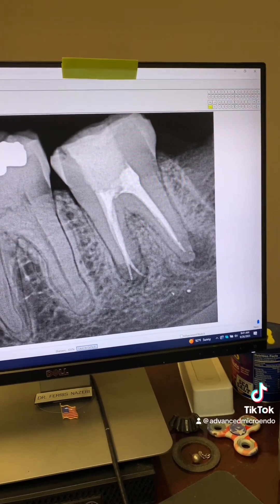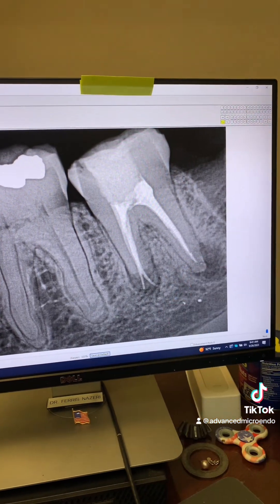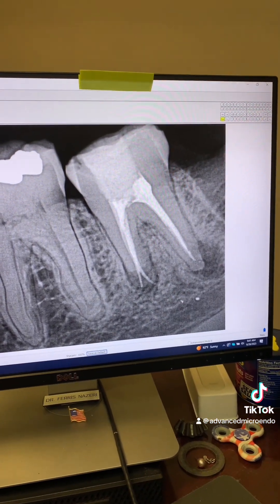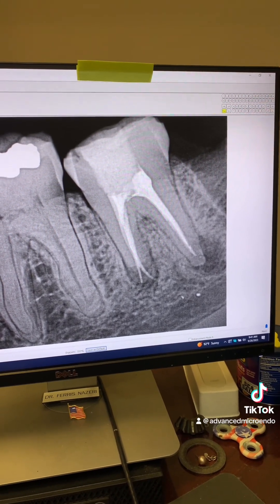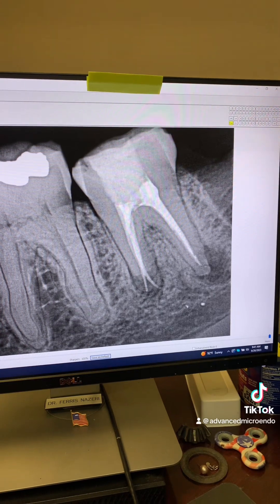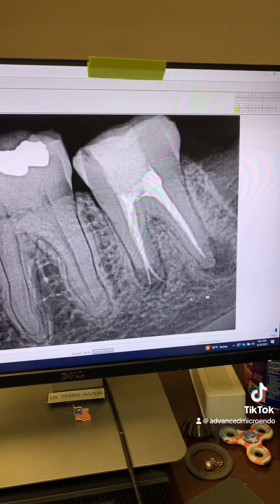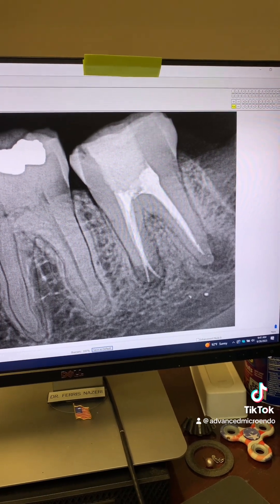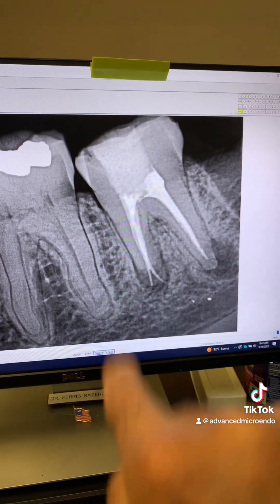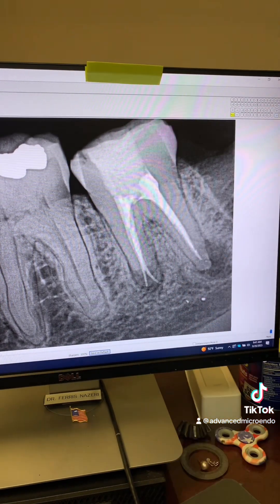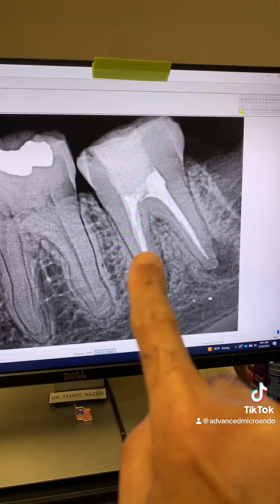This patient was referred to me for endodontic re-treatment of tooth number 18. According to the patient, the root canal was done a few years ago by her previous dentist. The tooth started to hurt a few weeks ago — hurt a lot. She went and saw her dentist and was told that her tooth was abscessed and referred to me. As you can see, there's a composite buildup here, a previous root canal, and a large periapical lucency here.